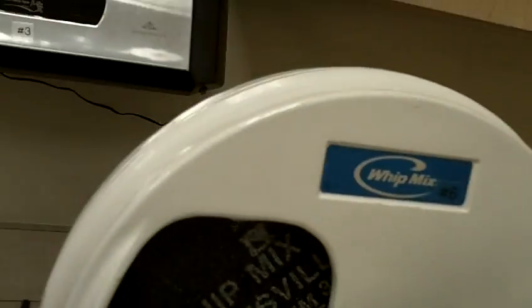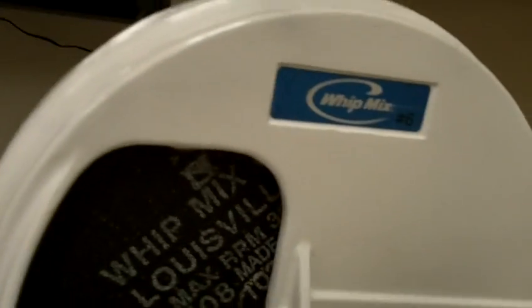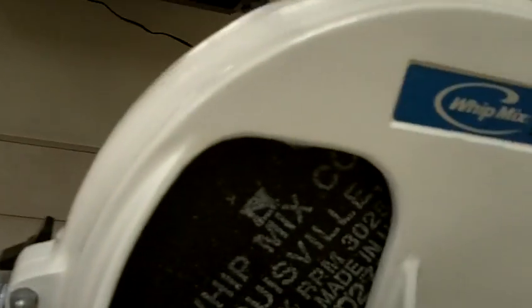and you come over here to clean up your machine. You clean up your area, and this really needs to be the entire thing. So here's where you may have your microfiber towel. Clean up your entire area, okay?